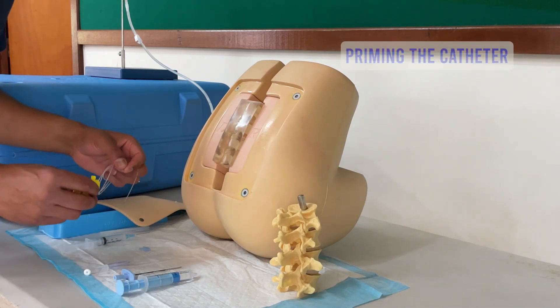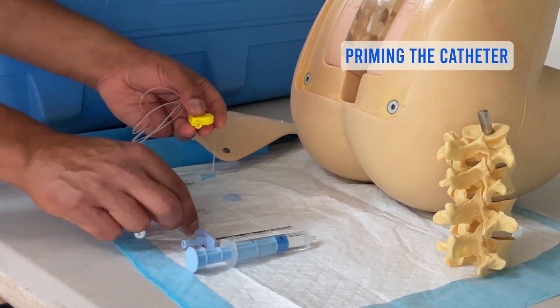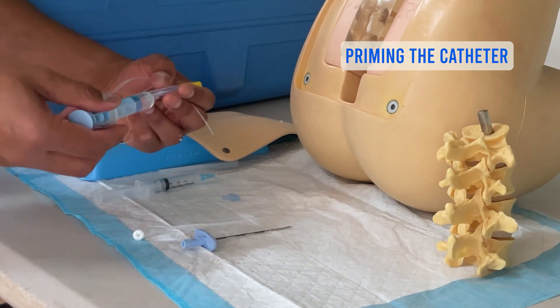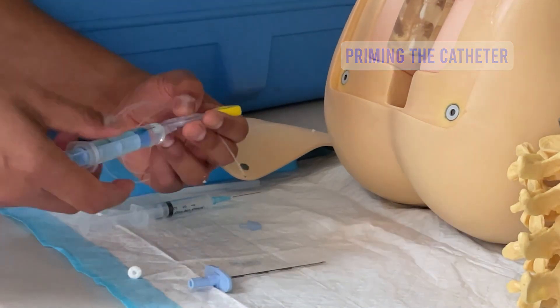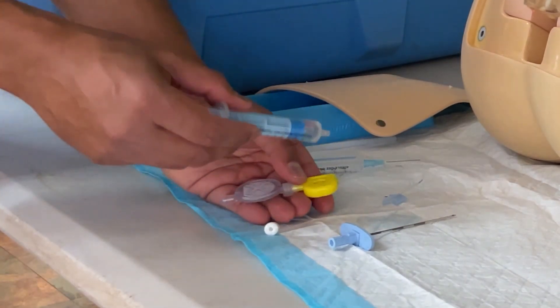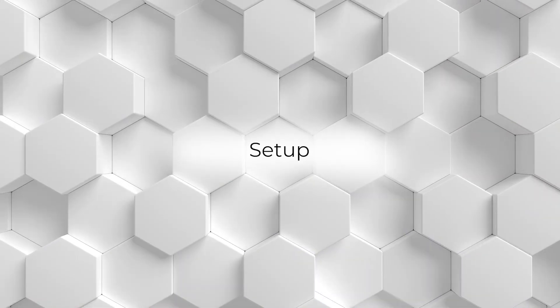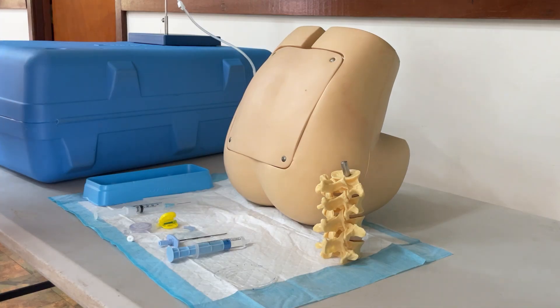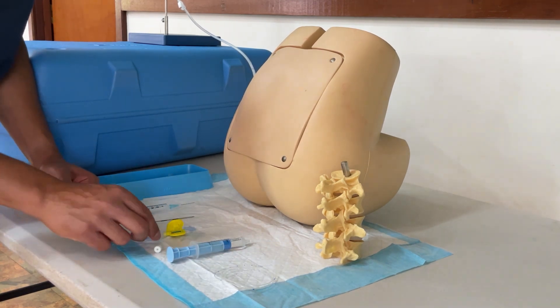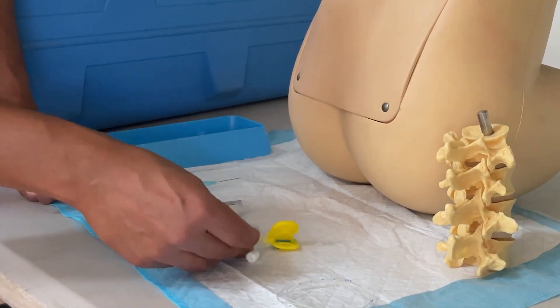The very first thing I do is flush this catheter. I insert it into the locking mechanism and clasp that shut, place the filter needle on with the luer lock, then put a syringe with saline and flush the catheter — you'll see saline flowing out of the tip. You can't leave the filter on, otherwise you won't be able to thread the catheter. I line everything up as I'm going to need it: local anaesthetic with lignocaine 1% first, then my epidural needle with saline, and after I've found the space I'll thread the catheter.